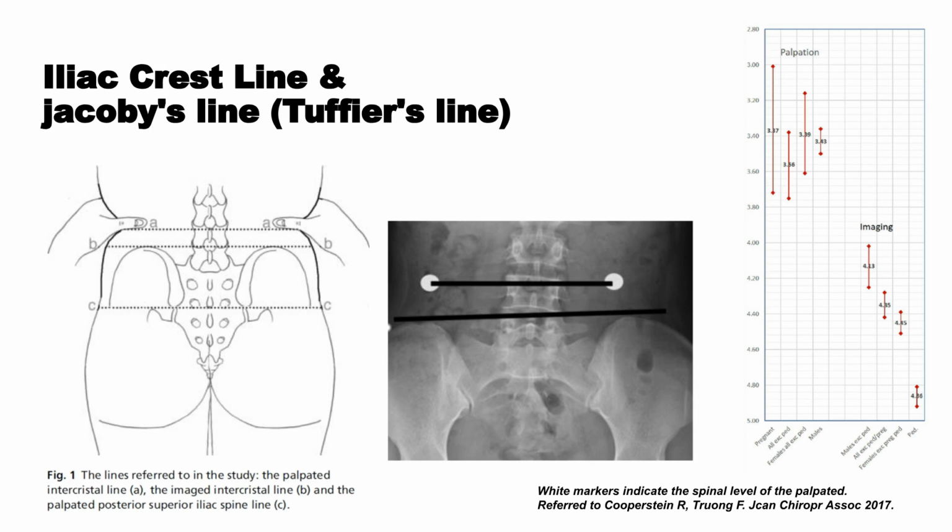But if we rely only on palpation, we run into errors because the thickness of subcutaneous fat varies so much from person to person. Clinical studies show that while X-ray or ultrasound can find the hip ridge accurately, when doctors use palpation, the assumed position of the third lumbar vertebra often changes.